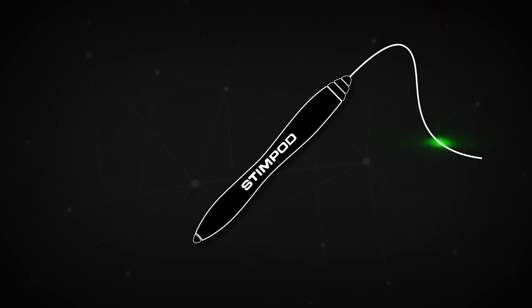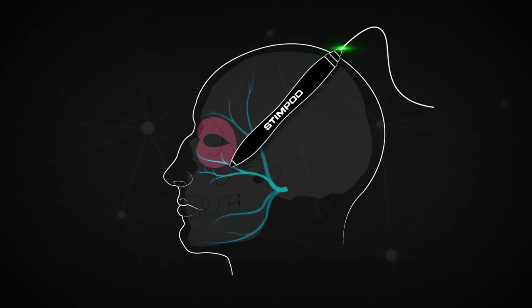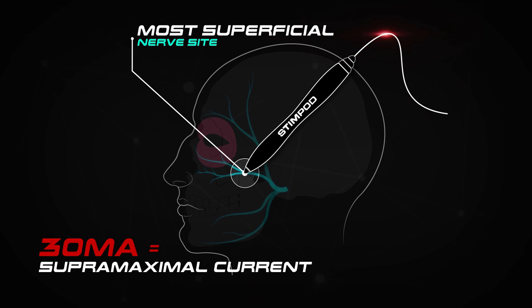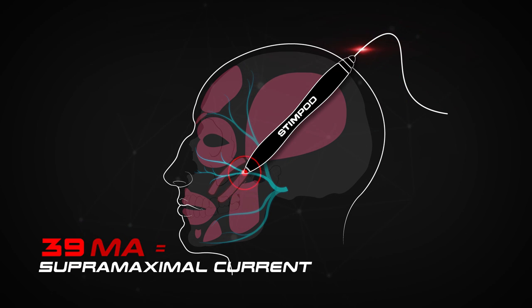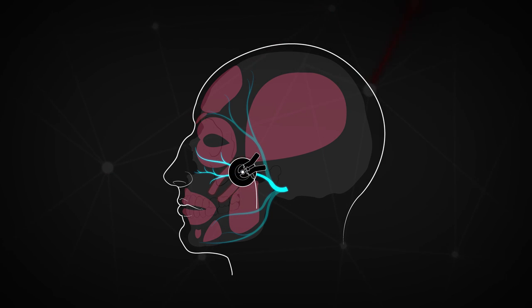We specifically recommend that the nerve mapping pen is used at a current between 8 and 10 mA. If a strong contraction is found at this current intensity, it can be assumed that a monitoring current of 30 mA will therefore sufficiently qualify as a supramaximal current. If the current is increased beyond 30 mA, however, chances are higher to solicit a response from the nearby muscles. The cathode or black electrode should then be placed on the most superficial aspect of either the zygomatic or temporal branch of the facial nerve.